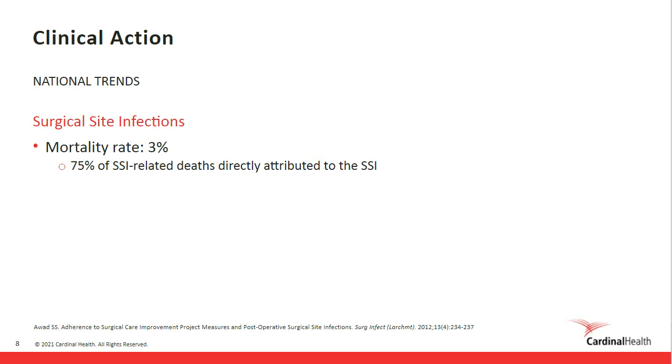However, as a telemetry nurse, I don't believe the best approach to reducing SSI in my practice is to be thoughtful about which patients might go without an ECG. This is because oftentimes our patients are so critical that telemetry is not optional. It is essential to the plan of care. Instead, I was inspired to reduce pathogen exposure by driving the adoption of single patient use ECG leads and lead wires.